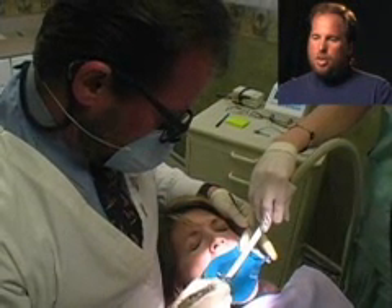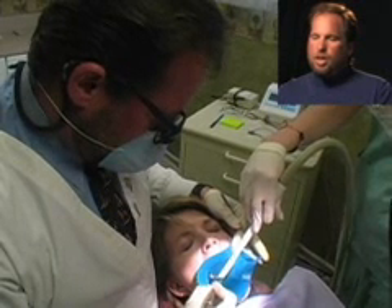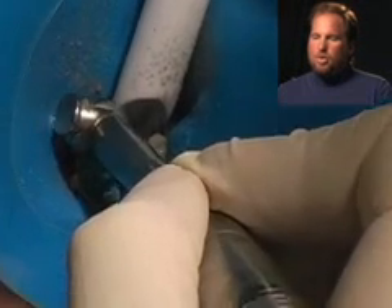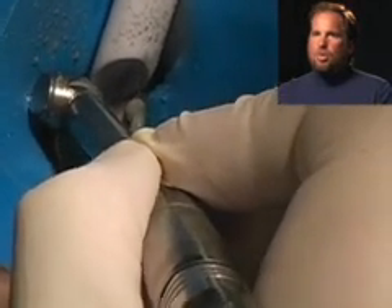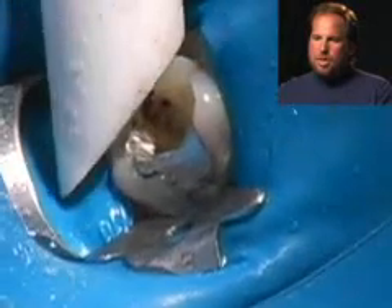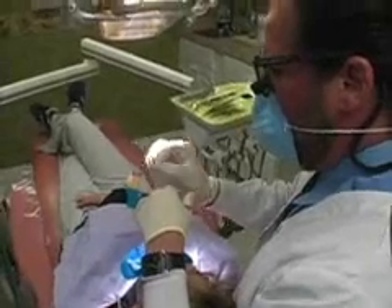Then we open the tooth up. When we do root canal, we're basically removing the nerves and blood vessels inside the tooth. But the first part is very much like a routine filling like you would normally get. So I'm just basically opening the tooth — it's called an access.